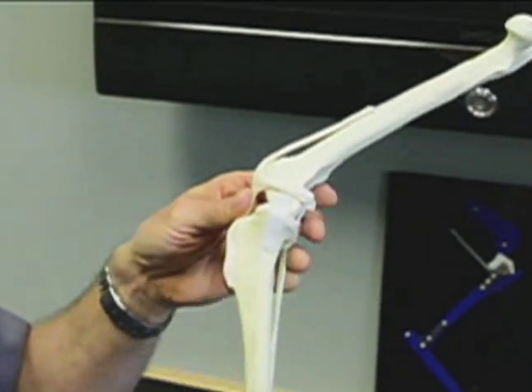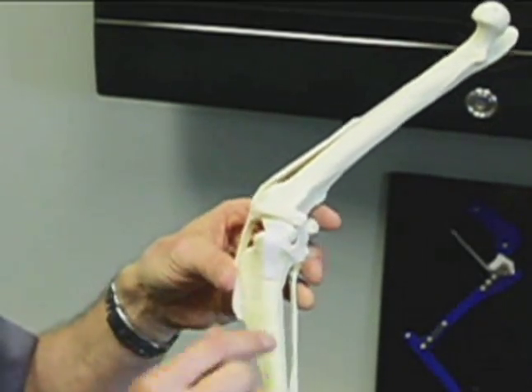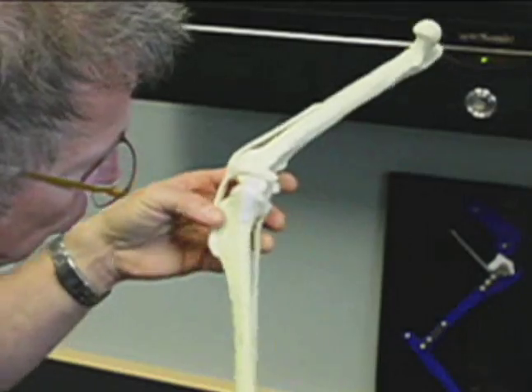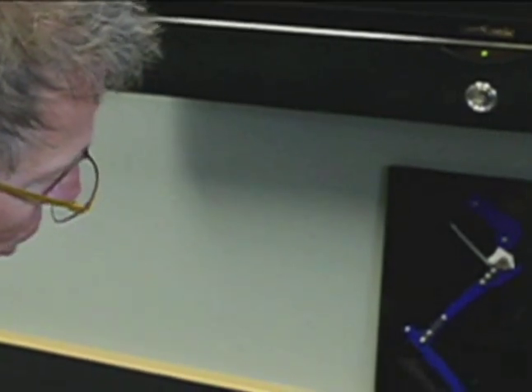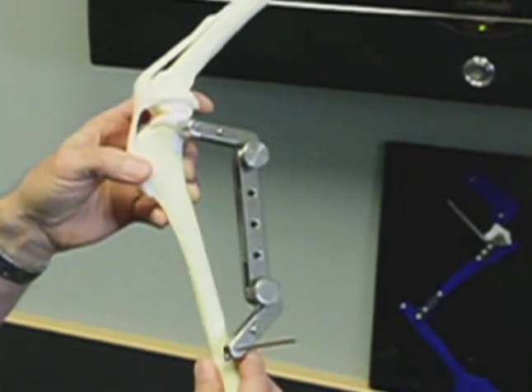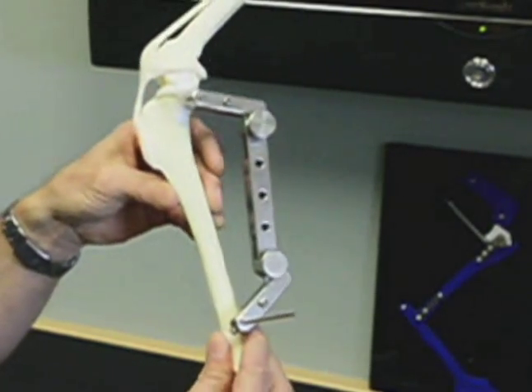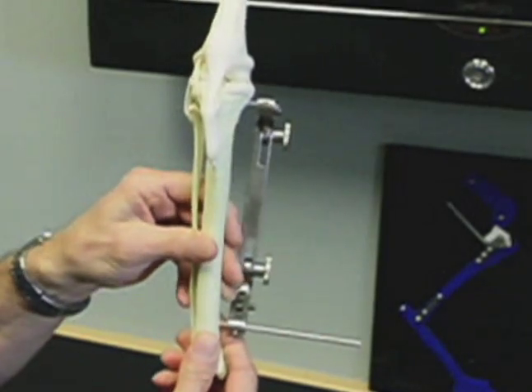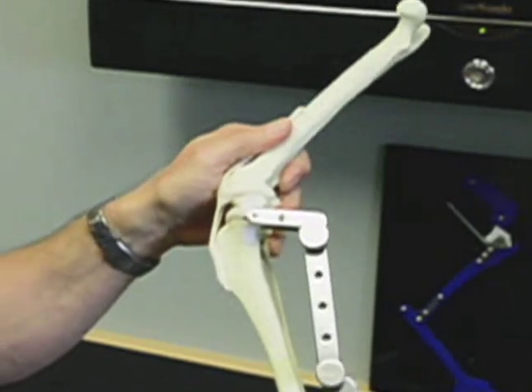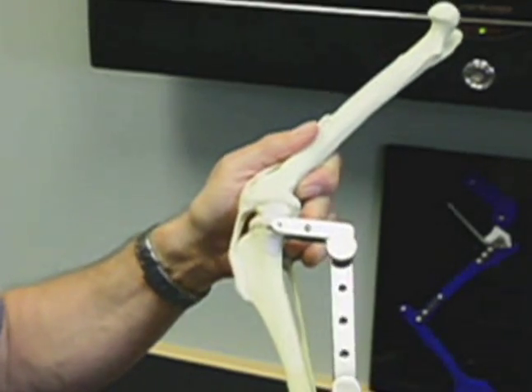Once we make the surgical approach to the bone, we're then ready to proceed with making our cut and doing the rotation. Most surgeons use a device called a jig. And the jig is placed on the leg using small pins to hold it in position. The purpose of the jig, once we've made our cut, is to hold the bone in appropriate alignment. Not all surgeons use a jig. I do, but it's personal preference.